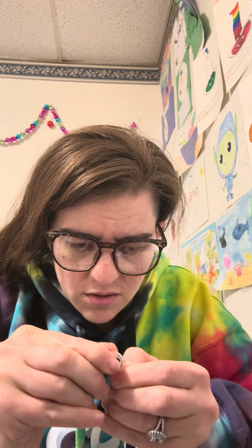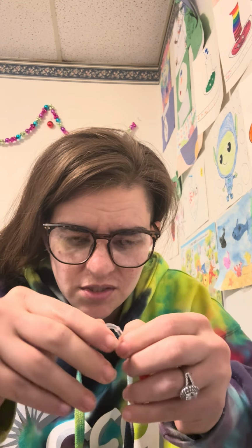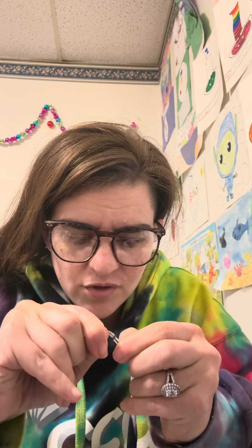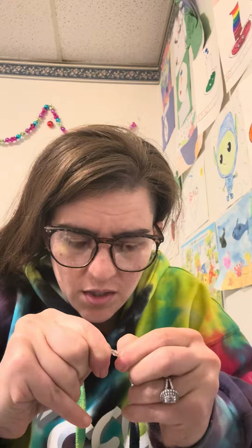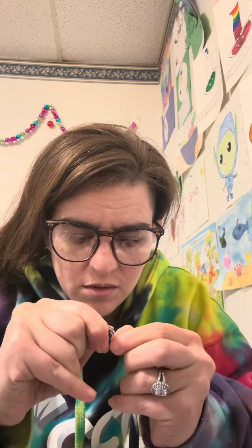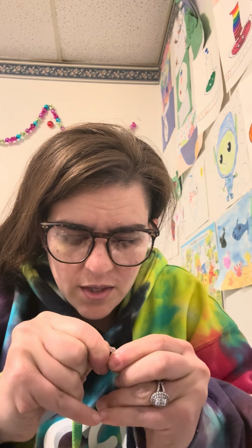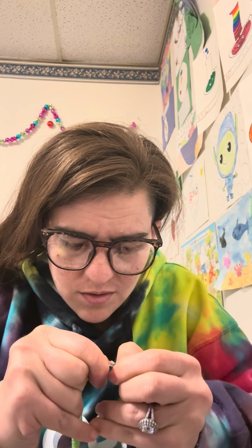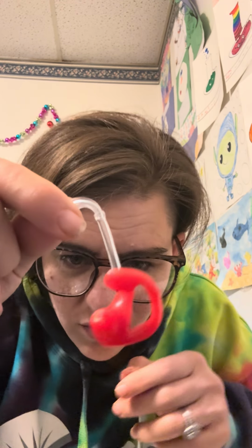Sometimes I actually feel like it's easier to take it off the hearing aid and push it on the hook, because you have more leverage holding the hook, because the hook can pop off the hearing aid. So you just stick it in here. Let me show you. You might have to jimmy rig it and kind of wiggle it in there to get it on. And then it's on. Now you see how it's on? There's a little ridge right there. You don't want to push it over the ridge.